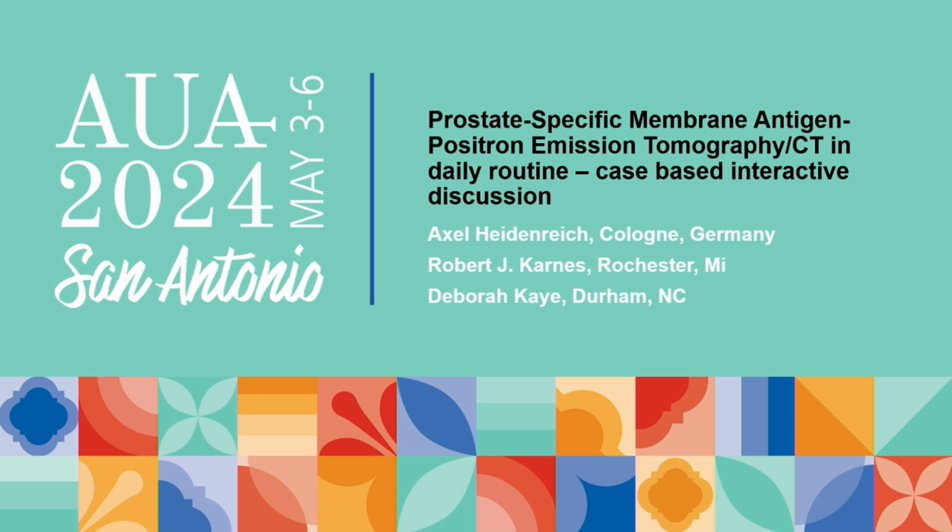You identify patients who have a PSA doubling time of more than 1 year, patients who have only 2 visible pelvic lymph nodes in the small pelvis, and patients who have a time interval between radical prostatectomy and visibility of this lymph node of more than 1 year. They have the highest chance to benefit long term from this type of salvage lymphadenectomy.